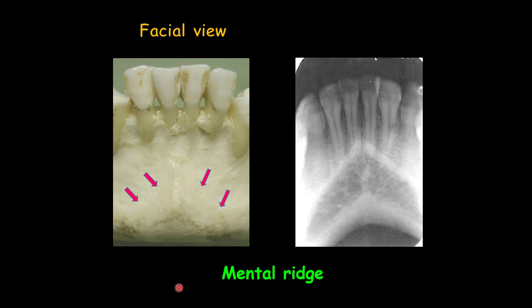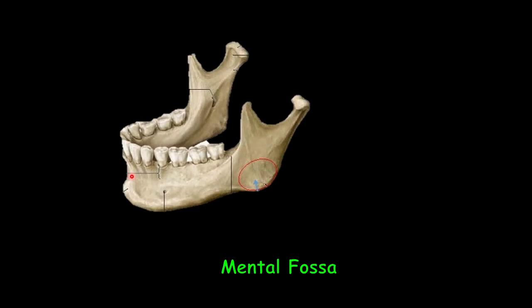On the practical radiographs of the mandibular incisors, the mental ridge is seen as two radiopaque lines splitting bilaterally, running forward and upward towards the midline. It can be variable in density and starting position — sometimes it starts in the premolar area on each side and goes up towards the midline. It can also be superimposed on the mandibular incisor roots.